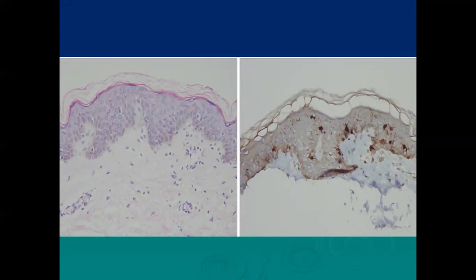Despite this hypopigmented nature, there is no disturbance whatsoever in melanocytes or melanocyte function. This is a DOPA reaction in which the melanocytes are highlighted. This is just a kind of eczema, and it resolves by giving topical corticosteroids or just moisturizing creams.